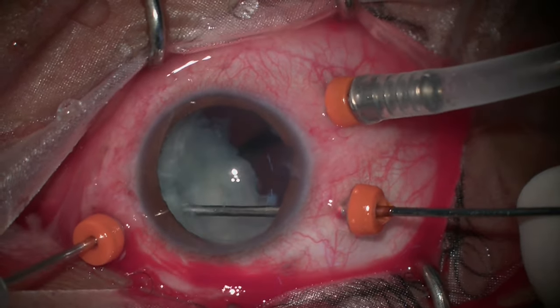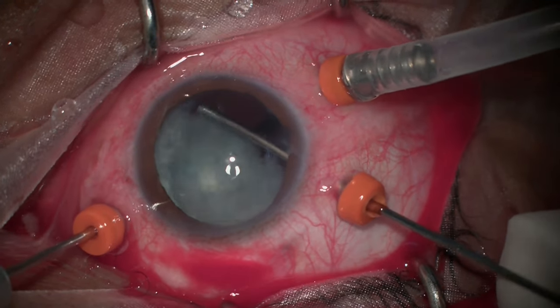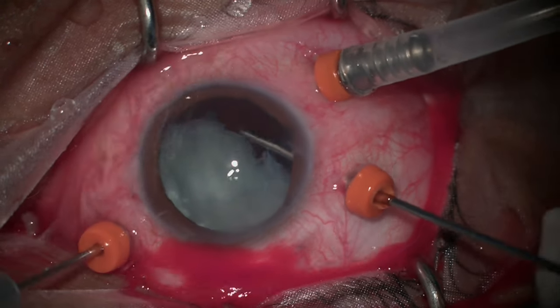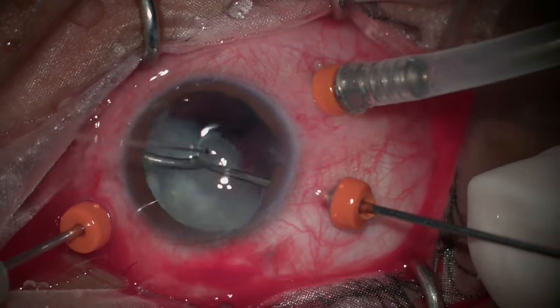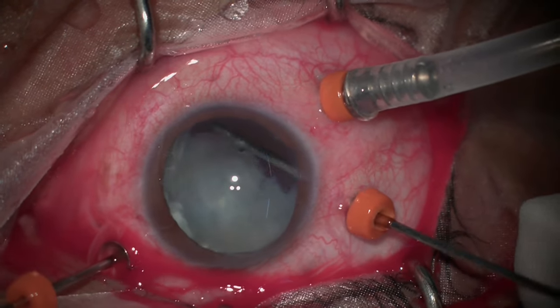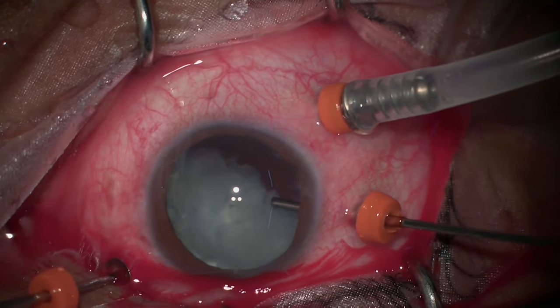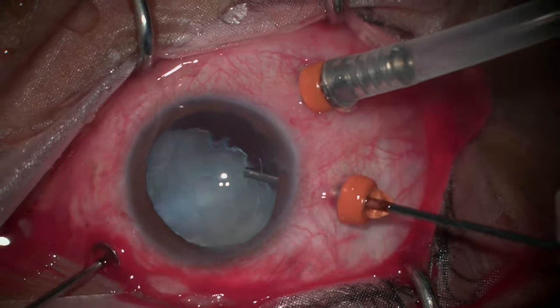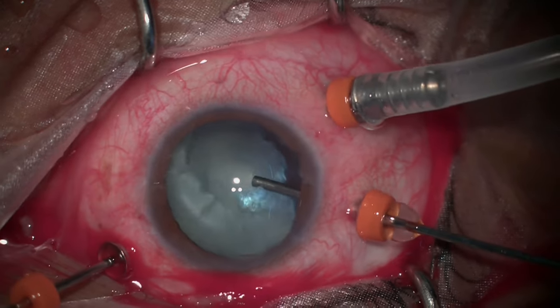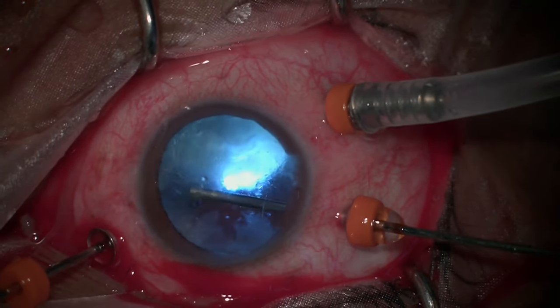The vitrectomy cutter is basically a guillotine-type cutter which uses aspiration via vacuum generated by the machine, and a cutter which reciprocates back and forth — whatever is aspirated into the port is cut off.